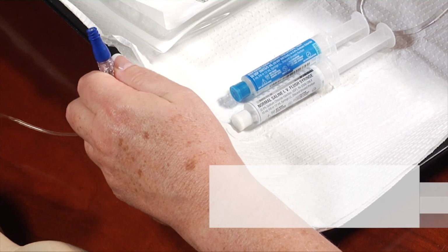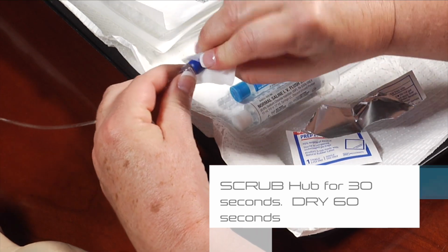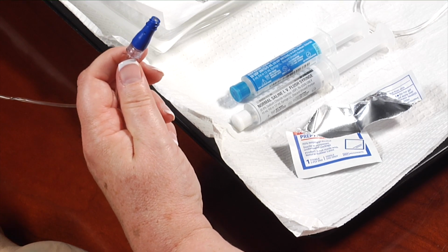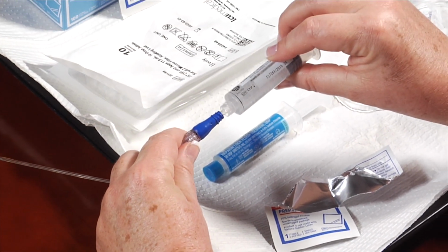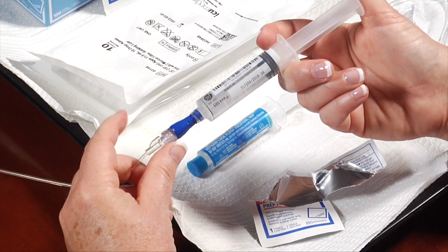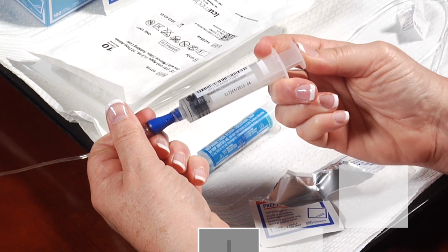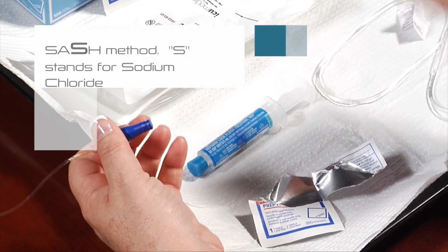Scrub the hub of your injection cap vigorously for 30 seconds with an antiseptic wipe, and allow to dry for 60 seconds. Attach the pre-filled syringe of sodium chloride to the end of your injection cap by pushing and turning clockwise to secure the syringe in place. Flush the catheter with the prescribed amount of sodium chloride as directed by your nurse using a push-pause method. SASH method. S stands for sodium chloride. Disconnect the syringe.